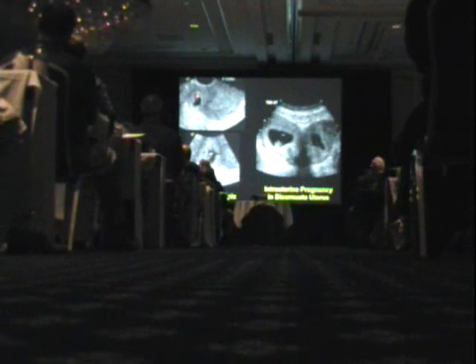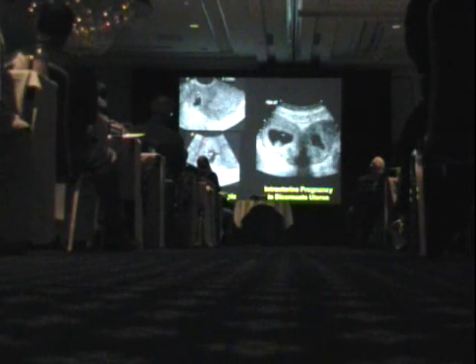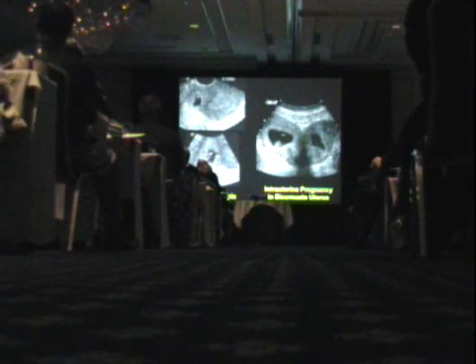And another side-by-side pair. This is a cornual ectopic, no myometrium around the lateral aspect. Similarly here, there's a heartbeat, trophoblastic tissue, but no myometrium. And here's an intrauterine pregnancy in a bicornuate uterus again. Fluid in one endometrial cavity, pregnancy in the other.